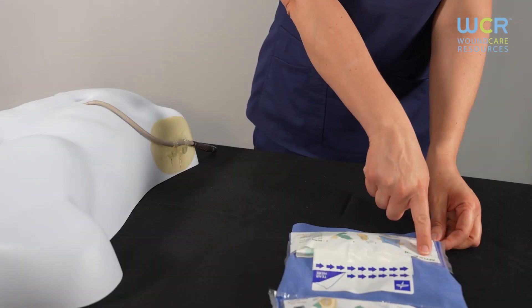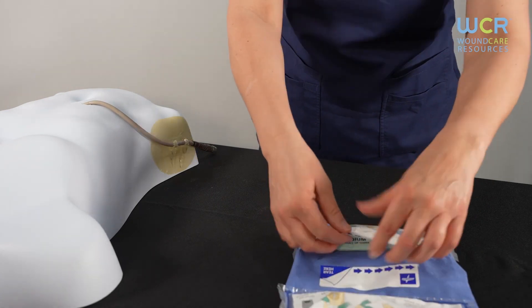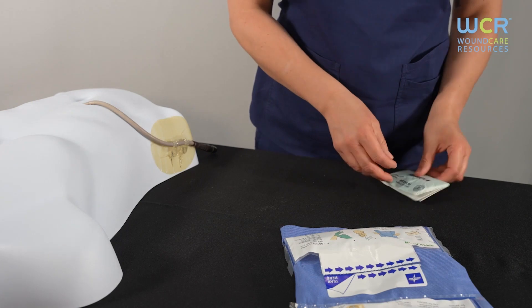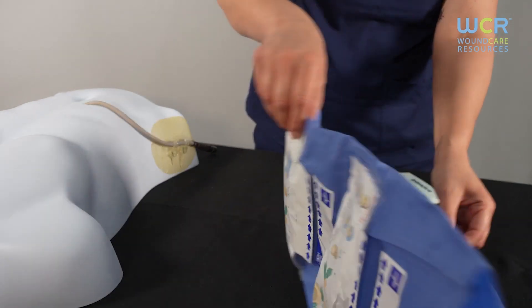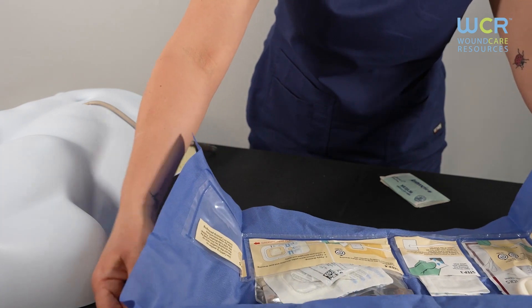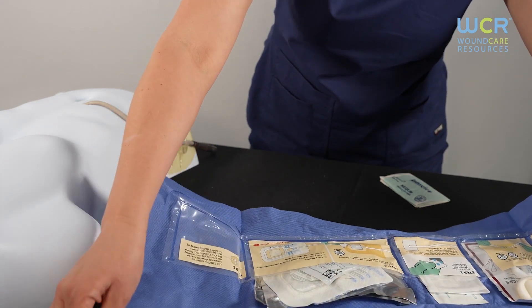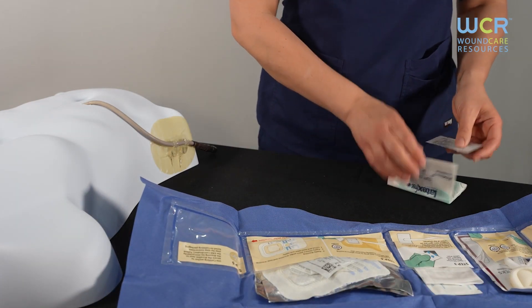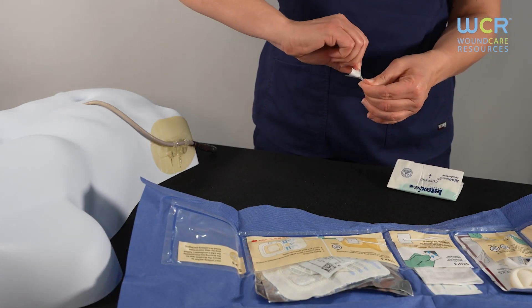Next, move to the application section. Tear open the pocket where it says 'tear here' and remove the hand sanitizer and sterile gloves — set these aside. Open the drape by pinching the 'pinch here' labels, avoiding touching the inside of the sterile drape. Once the kit is open, use the hand sanitizer you set aside, allowing your hands to dry completely.